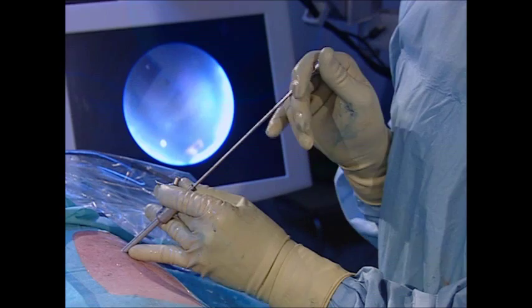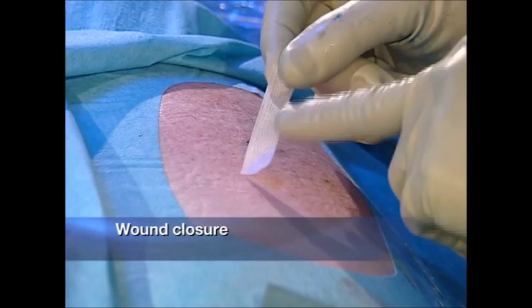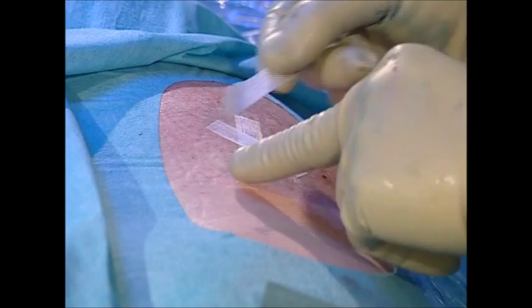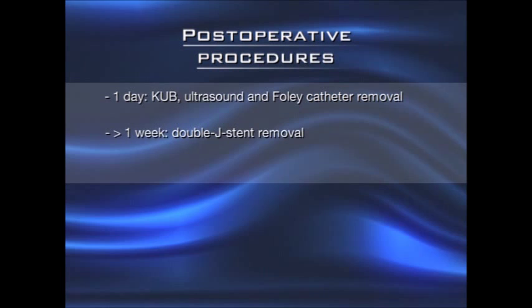The remaining substance is inserted at the renal capsule with the help of the pushing device. The wound is now closed with sterile strips. Following the intervention, on the first post-operative day, the absence of residual fragments is documented by a KUB and extravasation is ruled out by ultrasound examination. The Foley catheter is removed. The double J stent is removed after about a week in stone-free patients. If residual fragments are still present, a flexible URS is carried out during the following weeks.